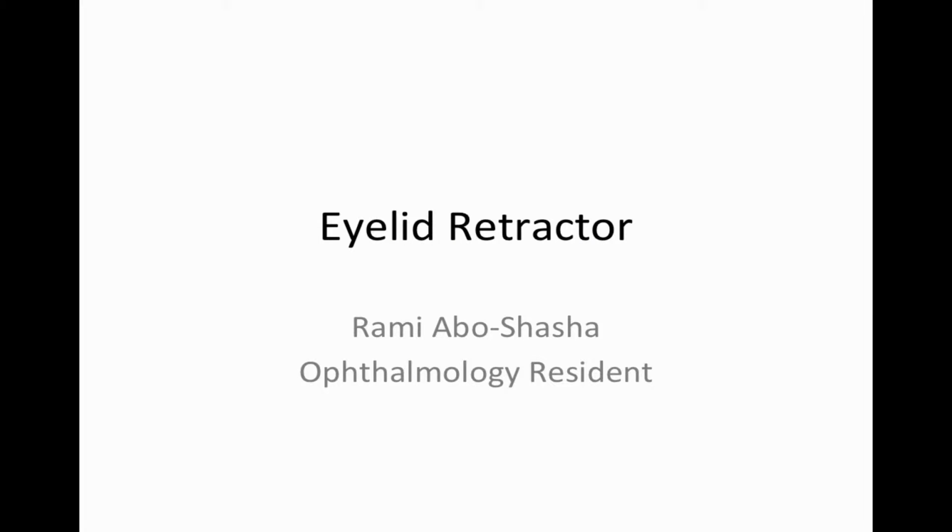Hi everyone. In this video we'll be going over the use of eyelid retractors in the ophthalmology clinic and indications of when to use them both in clinic and in the operating room.